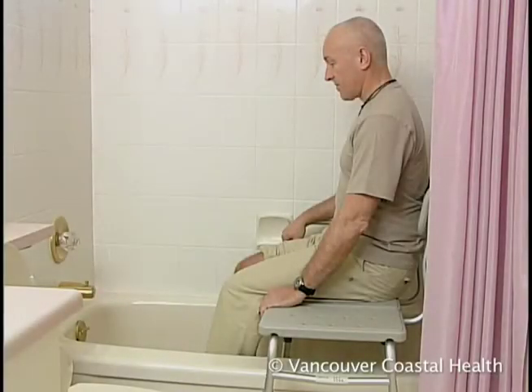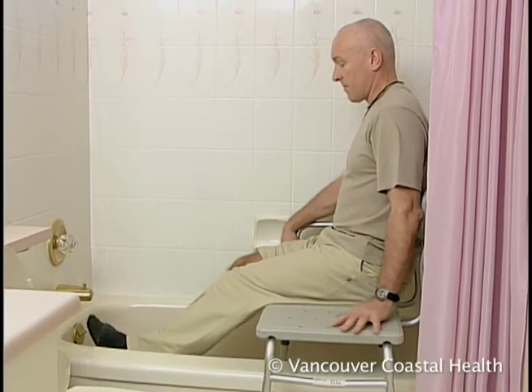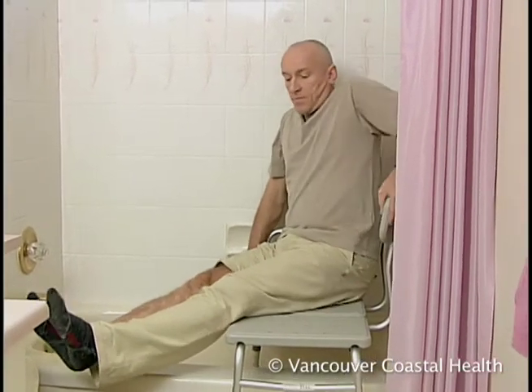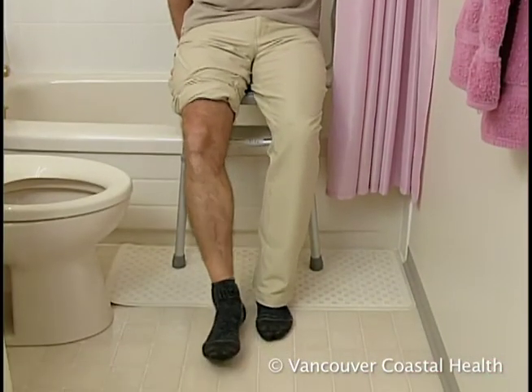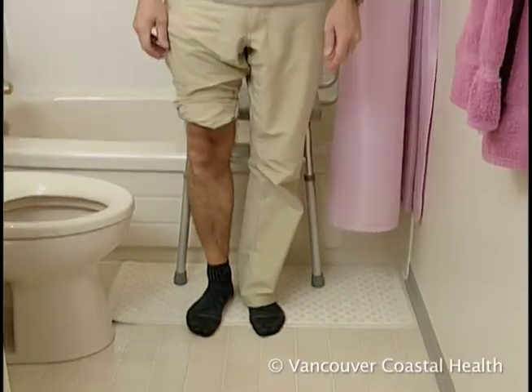To get out of the tub, bring your legs to the side and swing them over the bathtub. Slide to the end of the bench, hold onto the back of the chair, extend your surgical leg, and then push with your arms and good leg to stand up.